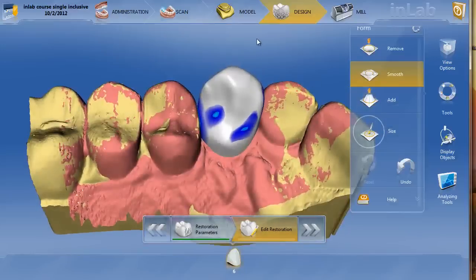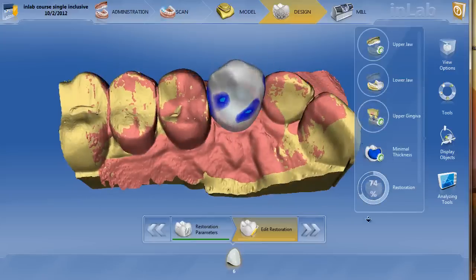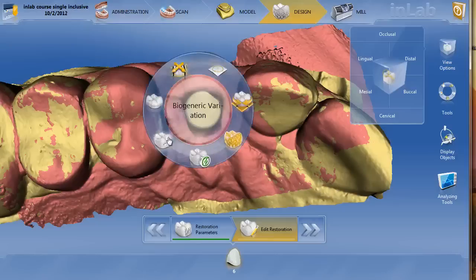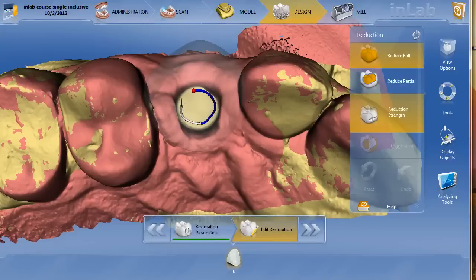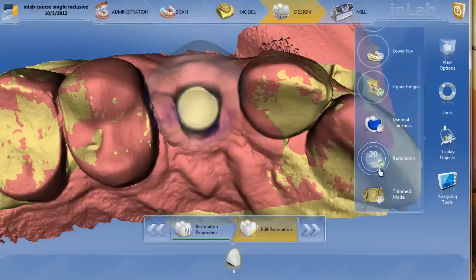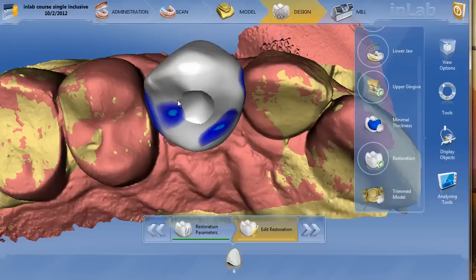Now the next thing we have to do is form our screw access hole. We'll turn our restoration transparent, turn off our minimal thickness, and go to view options. Get it to the path of the milling insertion on the occlusal, then right-click and choose reduce. Simply draw a line around where you want that access hole to be. We're going to take the reduction strength all the way to 1.5 as far as we can go. Turn off the reduction tool, go back to display objects, and make our restoration back to non-transparent. Now we've got exactly where that screw access hole needs to go — nice and defined, just like it used to be with 3.8 using that shape tool.